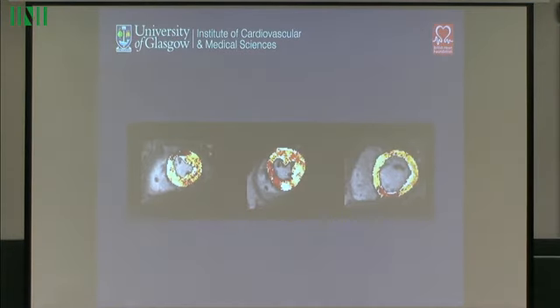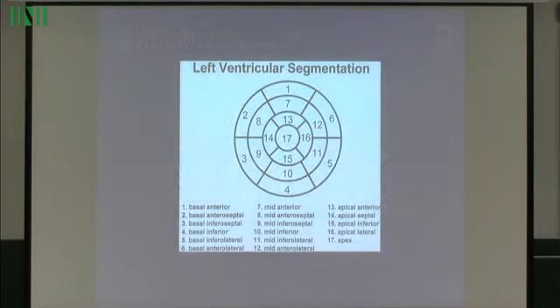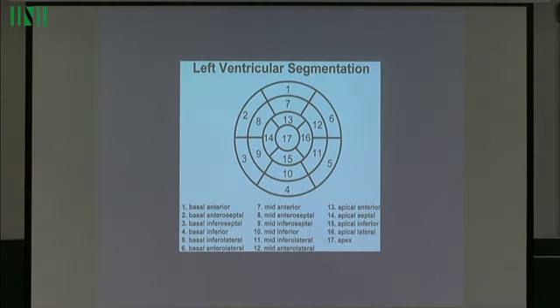We are then faced currently with the need to smash it, to destroy it, to fit an accepted grid that's proposed by the American Heart Association, and then report it, regardless of the resolution that we acquire it in and the trouble we go through. We need to use the AHA model to report it in our papers.